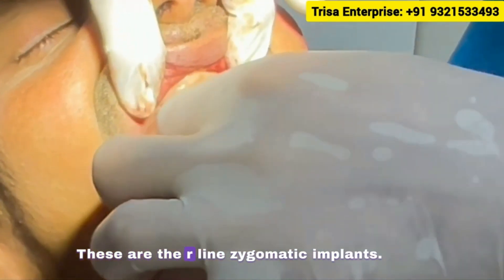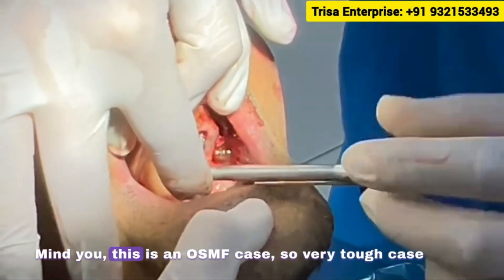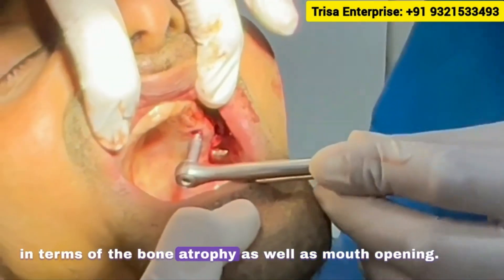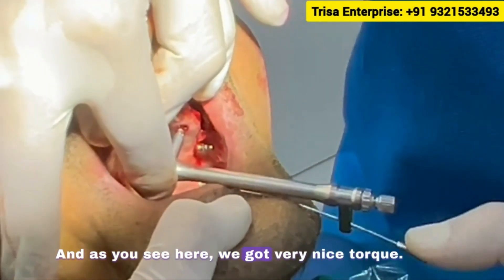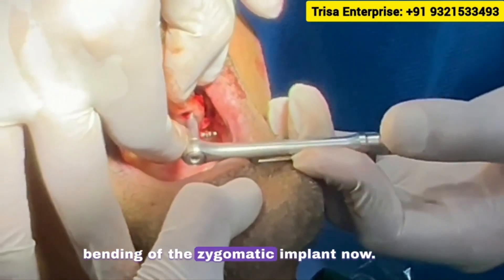These are the R-line zygomatic implants. Mind you, this is an OSMF case — a very tough case in terms of bone atrophy as well as mouth opening. As you see here, we got very nice torque, and I will show you the bending of the zygomatic implant now.